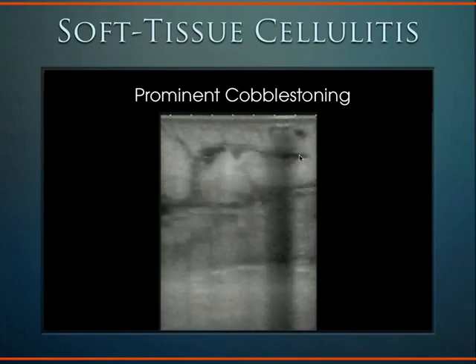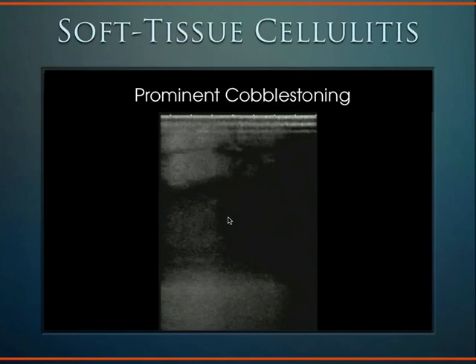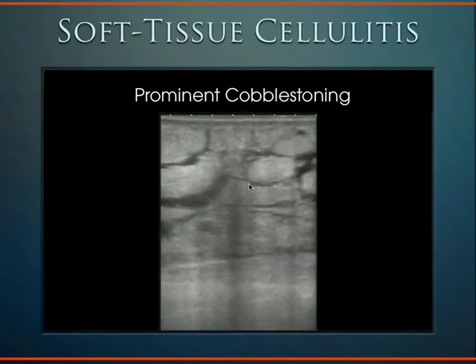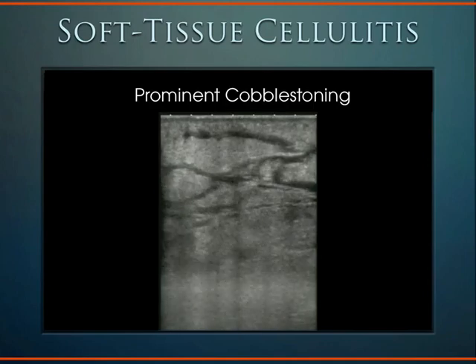Instead, he had cobblestoning. This is another example here of cobblestoning. You only need to treat with antibiotics. There's no reason to stick a needle in this patient here. This is just straight up cellulitis.